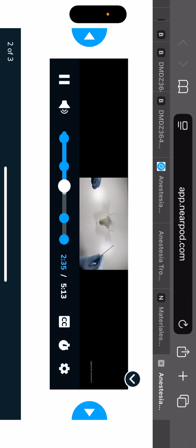The third thing to look at is when you have a panorex, so when you have a panoramic radiograph, sometimes you're going to see that there's not one canal, but there's actually two, or maybe even three. Now, three is very rare. You'll see doubles more than you'll see triples. So you'll see a bifid IAN canal that actually splits somewhere in the posterior region.